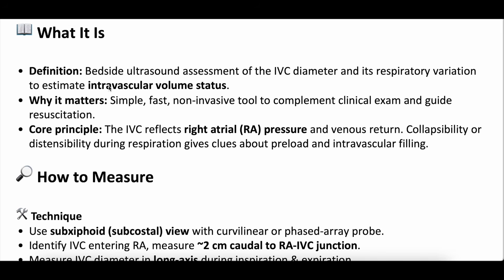The bedside ultrasound assessment of the IVC diameter and its respiratory variation is something we use clinically a lot to try to estimate intravascular volume status. You'll often hear: the IVC is small, we're giving them fluid; the IVC is big, we're not giving them fluid. But it's not necessarily that simple. We look at the diameter and size of the IVC, and how much it collapses with respiratory variation, using that as a surrogate for the patient's volume status.